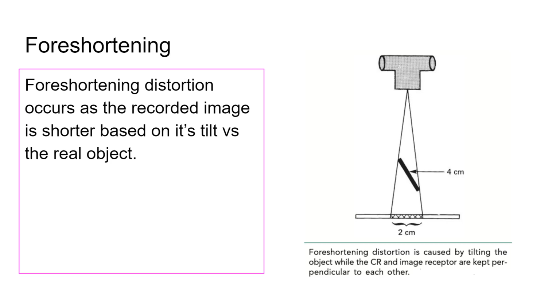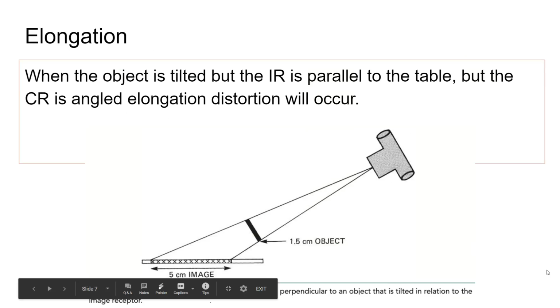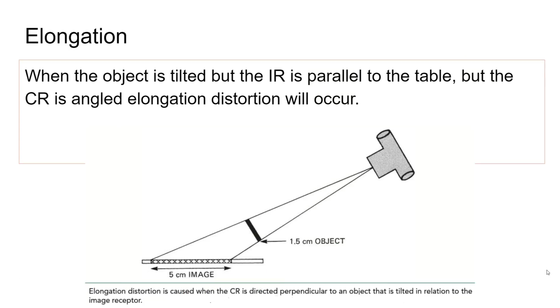I knew someone that did that, though. I think they fired her. She used to fluoro and then take an x-ray. Right, so she could see where the, like, to get the hip right in the middle of the image, she'd fluoro, find the hip, and then take an exposure. They literally tell you to not do that in the book. It has a term for it, actually. Yeah, there's a term, like, that you're not supposed to do that. Yeah, foolish would be an understatement. Yeah, we don't want to do that. Right? That was never a standard. Never, never, ever.